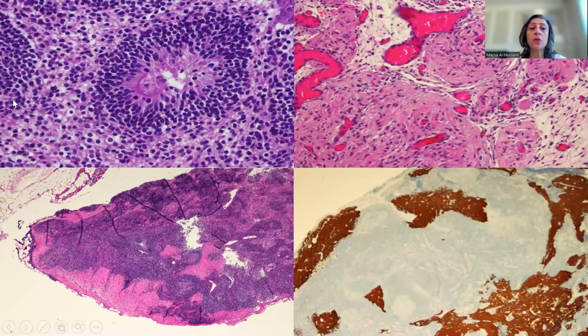So put together, this is the ovarian mass showing immature neuroectodermal component. Just to highlight, if this component is stained for GFAP, it is negative. So the neuroepithelium in the ovary is GFAP negative. This is the gliomatosis peritonei.